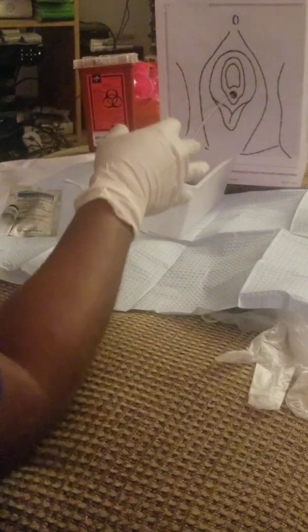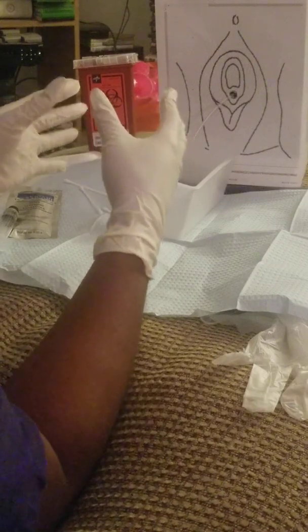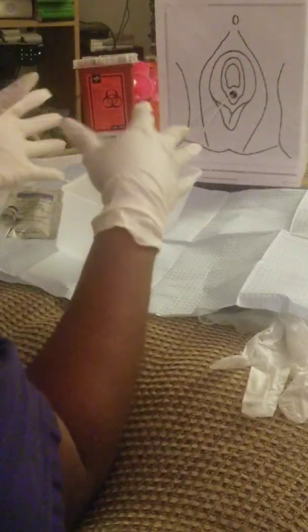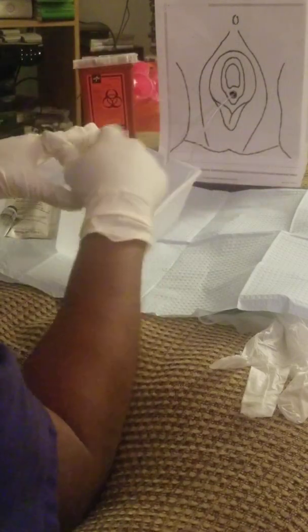Now, I know that it could be a little bit later in the video. I've been recording, so I honestly can't remember if I did say it because I've recorded this so many times. But again, if I did have a kit, I know the proper way to open this. You are supposed to open the kit away from yourself. You are supposed to make sure that you try to keep this entire area clean and sterile at all times. So I know things are to be opened away from me.